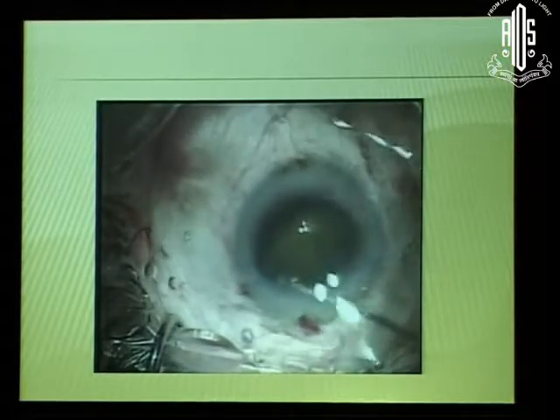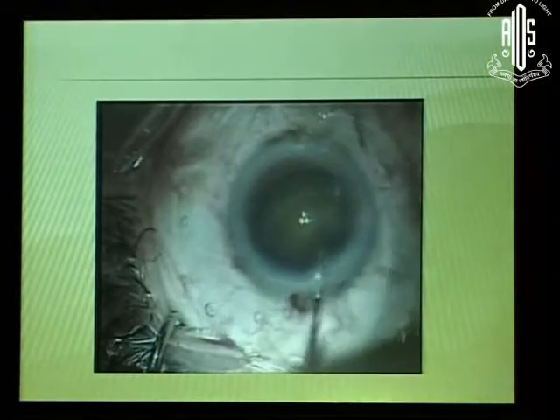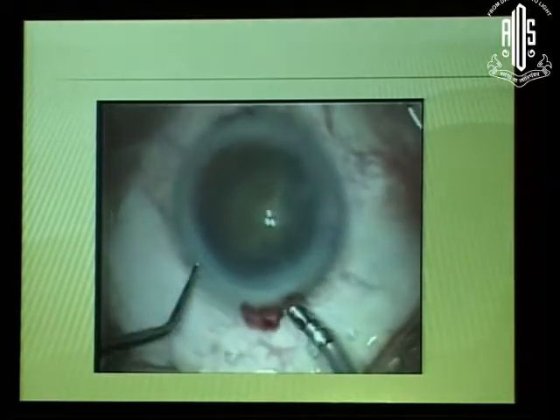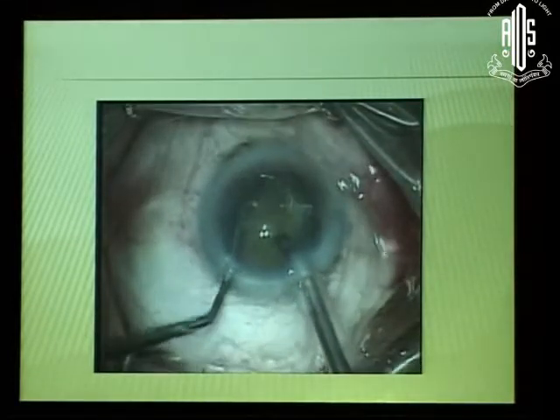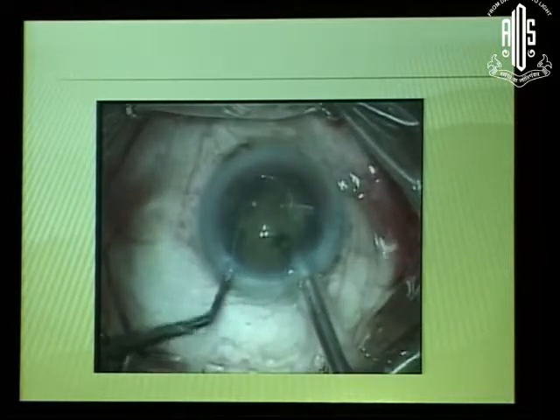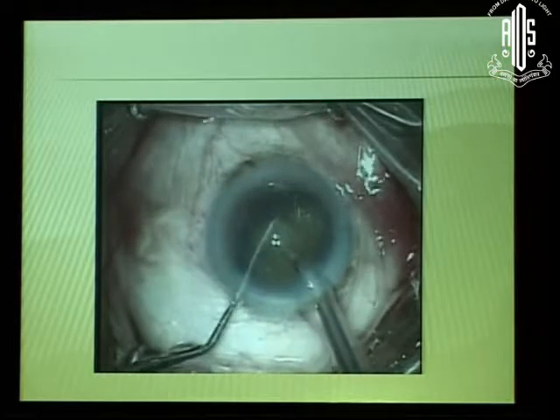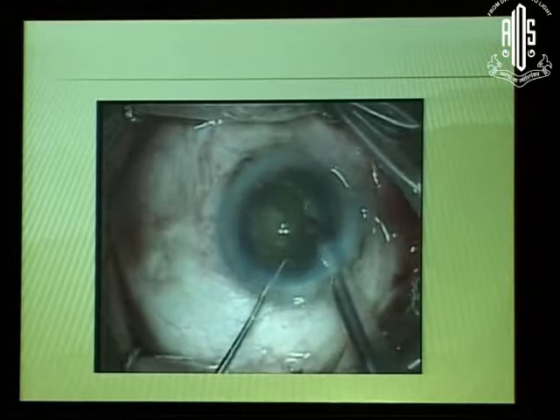Let me demonstrate to you on an actual case. You make the lens stand vertically, then you support it at the side and use your burst mode, which is a system I've showed you about. Burst multiple mode. Expose the phaco tip a little more than what you would normally do and simply embed it into the surface. Cut your suction down radically. It is set to only 80 suction. 80 suction is just enough to keep your bore clean. Let it embed, drain it out again, turn your lens around and embed it again.